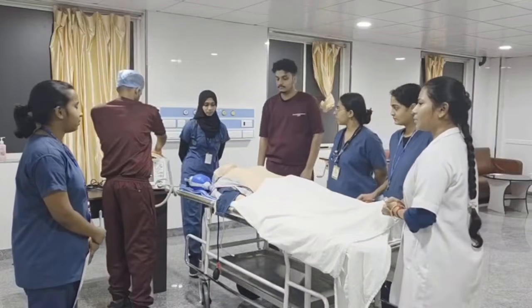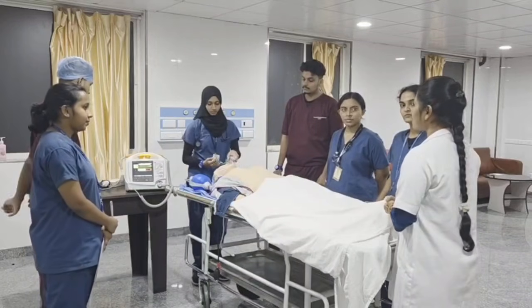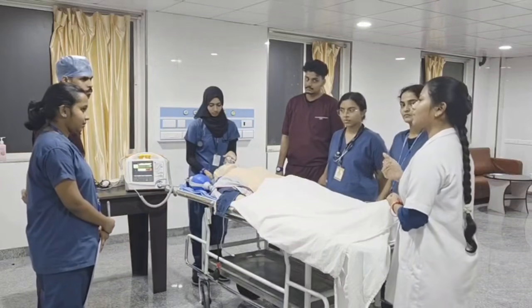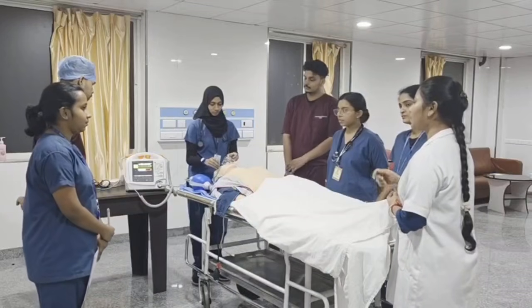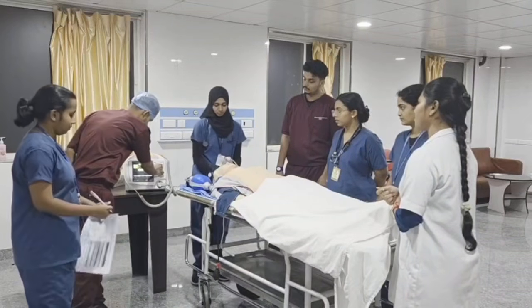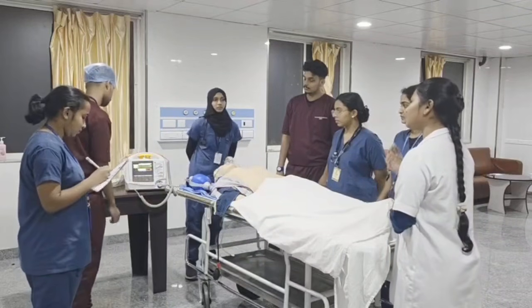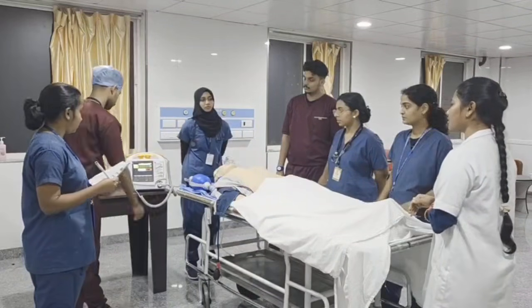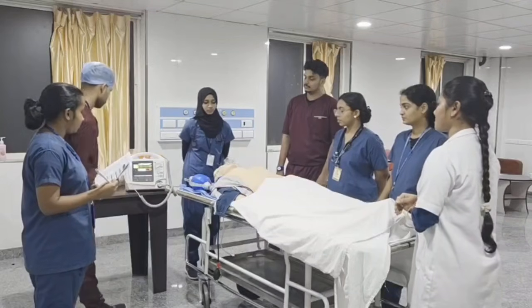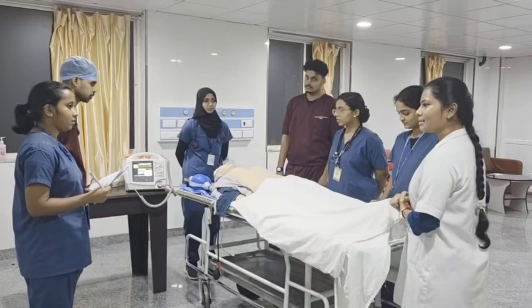Is it showing any effectiveness for the first synchronized cardioversion? No, the rhythm is the same. So we will be proceeding with a second synchronized cardioversion. Could you increase the energy to 200 joules? Okay, as the sync is on, just charge it and keep it ready. Synchronized cardioversion. So still the rhythm is the same?